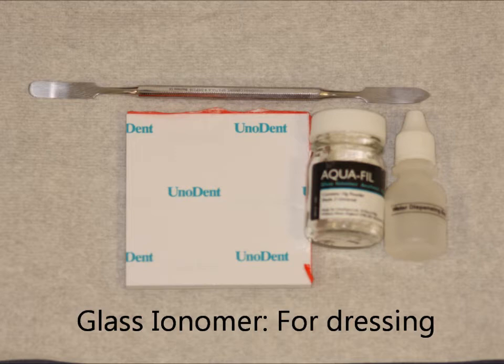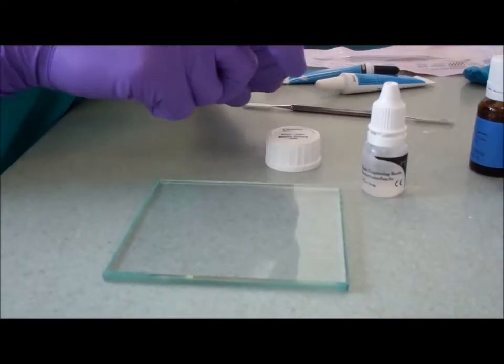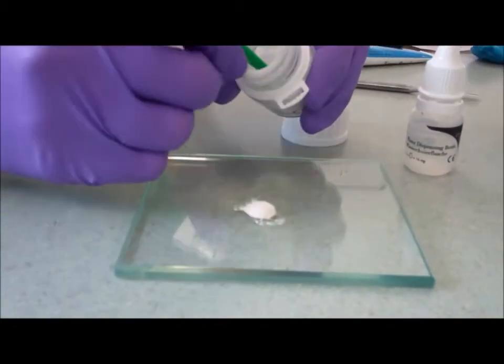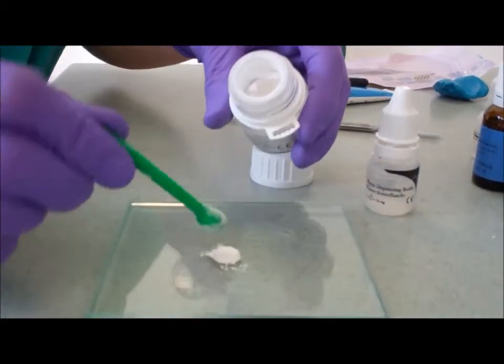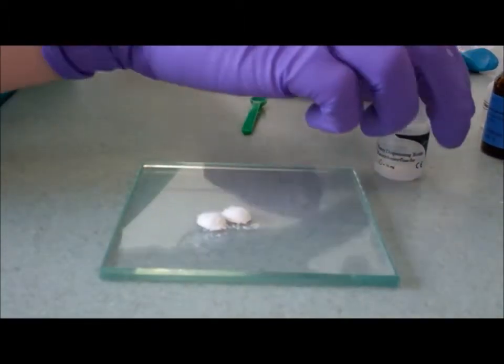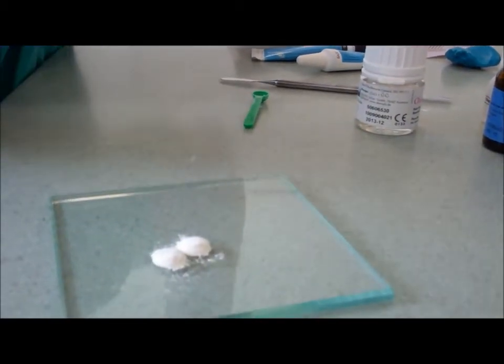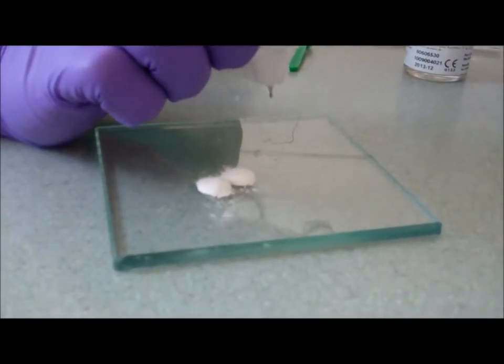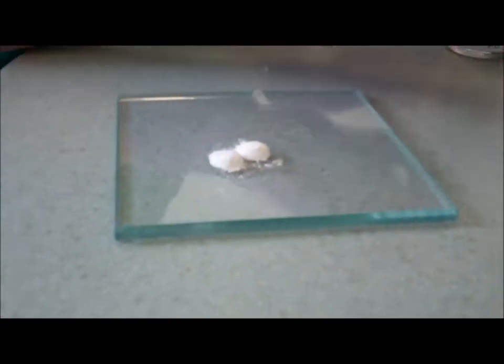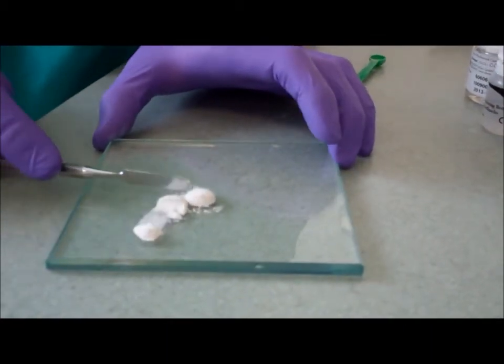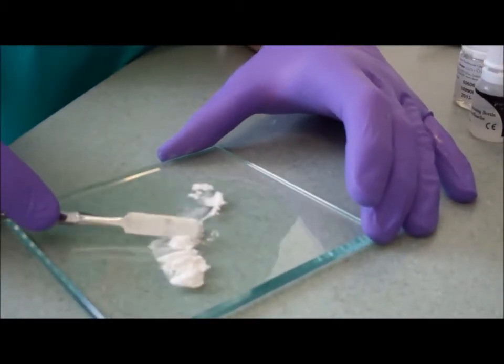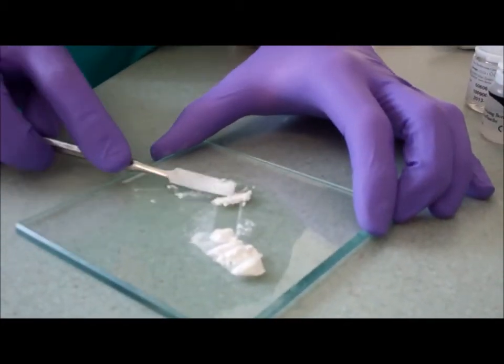If you want to mix glass ionomer for a dressing, again put out a suitable amount of powder, and then an equal number of drops from a dropper bottle onto the slab. Split your powder into increments, and gradually mix each increment at a time, making sure the powder is well incorporated into the liquid.